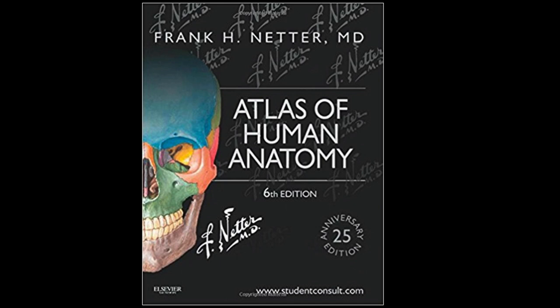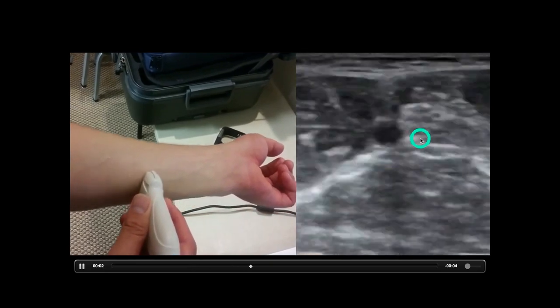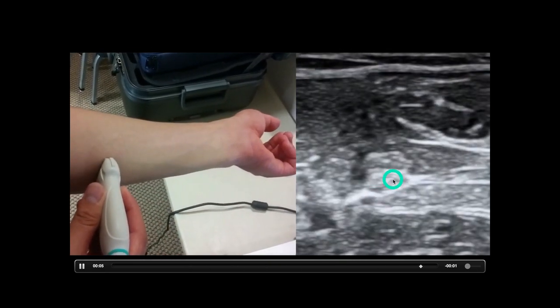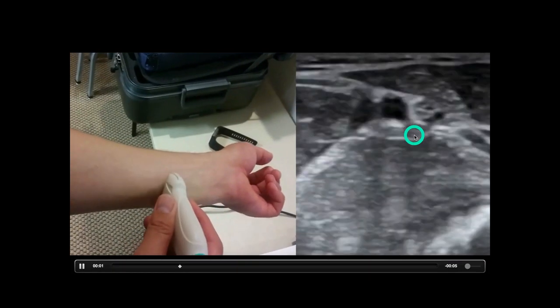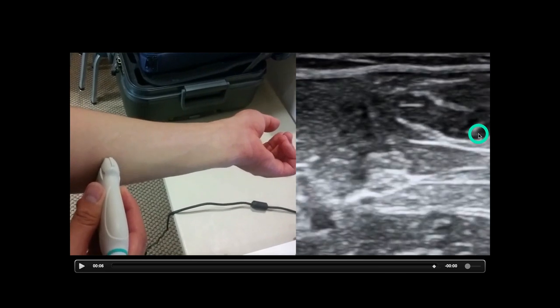Knowing your anatomy is also super important. Especially in the extremities, as you move further up — say you're doing an ulnar nerve block — the nerve stays as a structure and actually gets bigger, whereas the tendon will turn into muscle. Here is the transducer looking at the ulnar nerve right here, and right here is the tendon of the flexor carpi ulnaris. You can see the nerve stays as that same honeycomb structure while the tendon starts to disappear into the muscle. That's a big way of telling the difference.